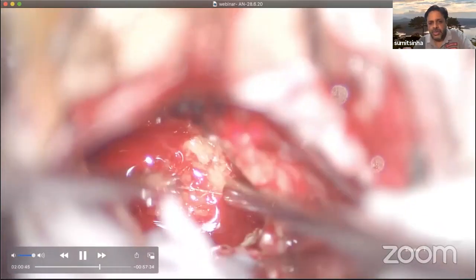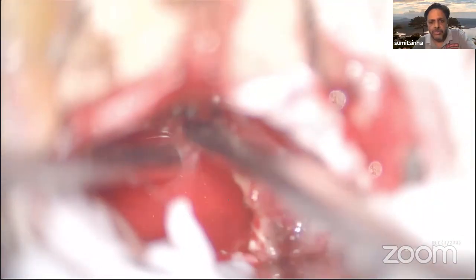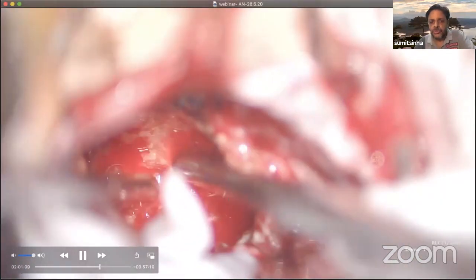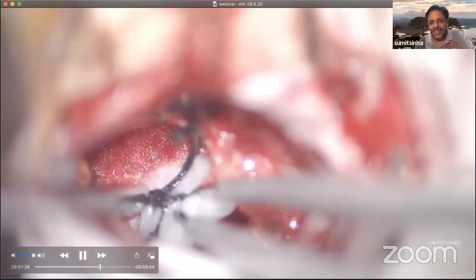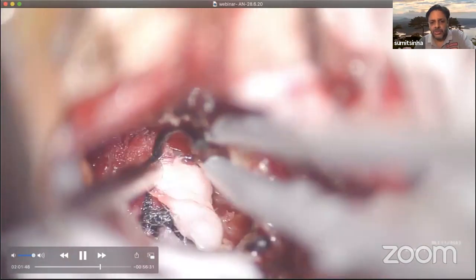Now in this case, I did not drill. I had not planned to drill the meatus because the tumor is not really going very much into the meatus. And so I would like to decompress that tumor from the porous of the meatus and then take out the tumor from there itself without drilling the meatus. There is no need to drill the meatus in this case per se.